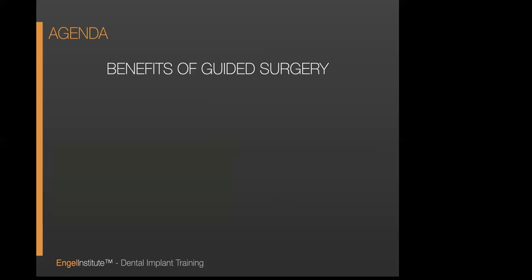So we are going to talk about this A to Z as quickly as I can. We are going to, again, remain agnostic about this, meaning I'm going to get to points where it's going to be specific to a certain implant, a certain kit, a certain guide, keys, keyless, etc. And at that point, I'll explain that we're going to break away and go to the next topic that would be pertinent for everybody doing guided surgery.